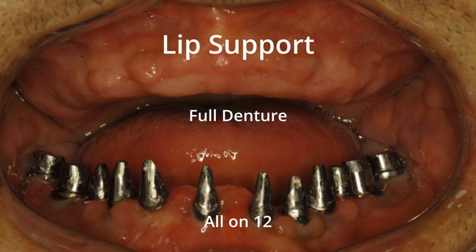If you have experience with Allon4 or Allon6, you know that lip support is often insufficient. Lip support problems are particularly common in maxillary AllonX cases. Patients often complain of sunken perioral areas or increased wrinkles around the mouth. If zirconia is thickened to increase lip support, the prosthesis becomes significantly heavier. This excessive weight of zirconia implant prostheses can cause problems.